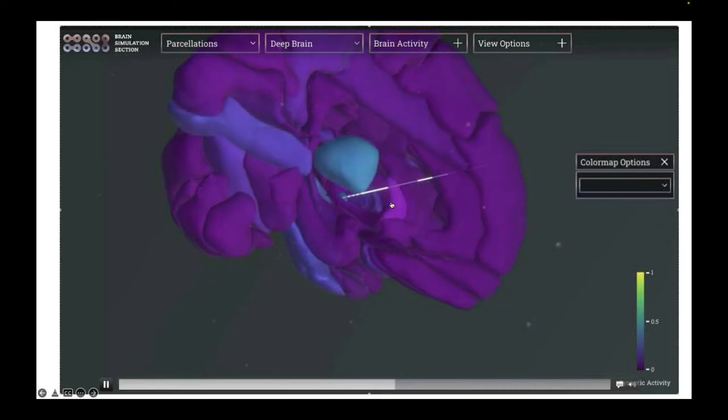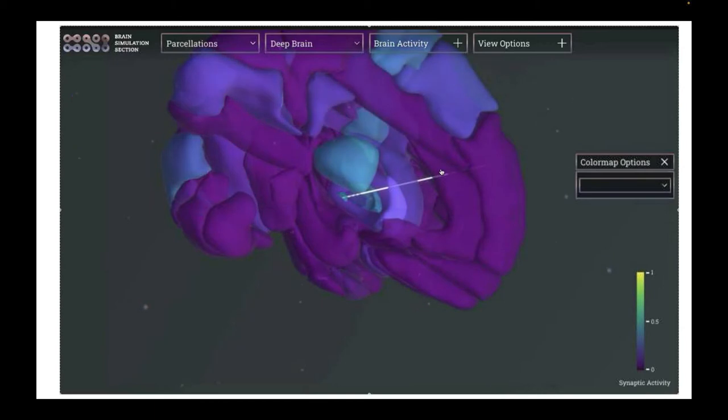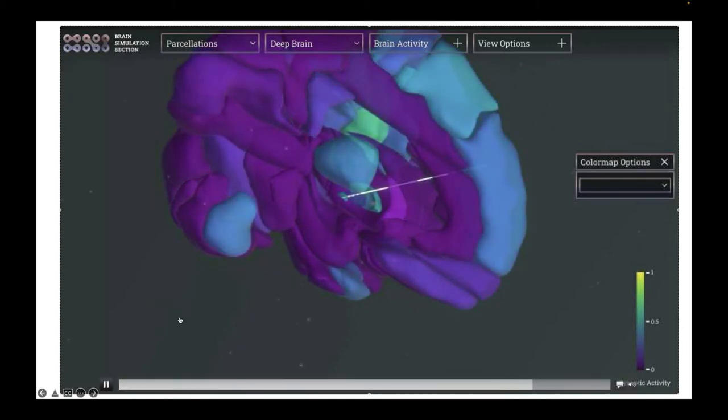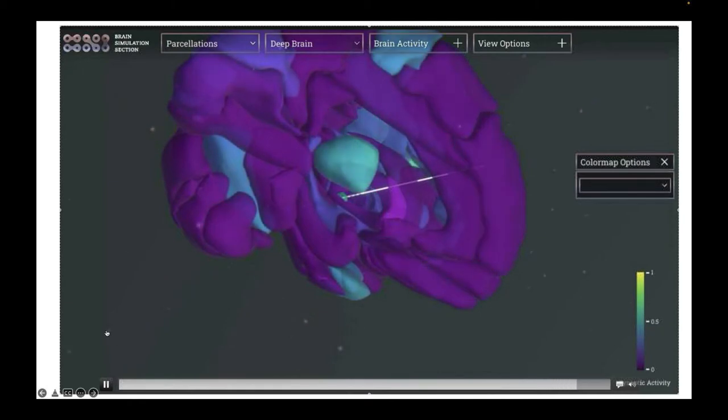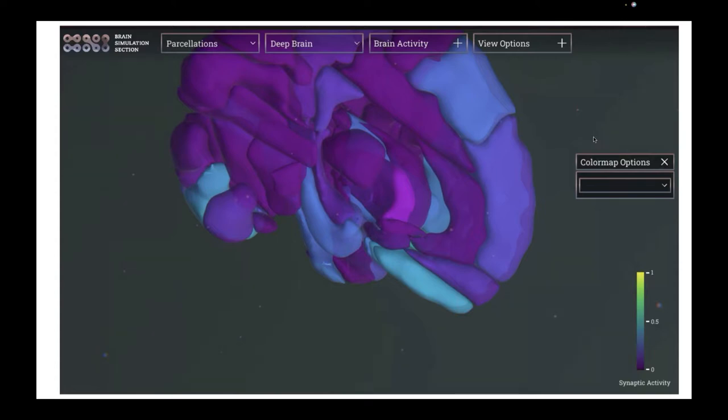This is a video of our results, where first you can see for the patient the resting state activity, where you see some regions lighting up. Oh, I clicked the wrong thing. So you first have to watch the resting state. Now the electrode is implanted, so our stimulus is given. That's the starting point of the stimulus. And you can see that some areas have much brighter colors. What does bright mean? Here it means more activity. And not only at the region of the STN and the surrounding tissue, but you can also see lots of frontal regions lighting up. So what we found was an effect not only on the basal ganglia from our simulated stimulus, but also on regions much further away.